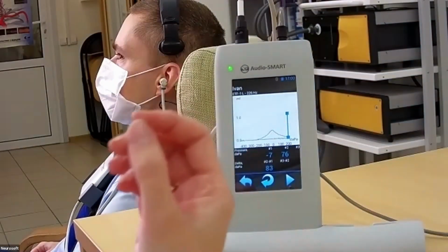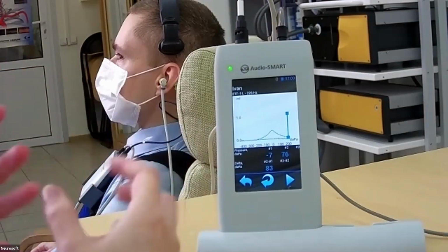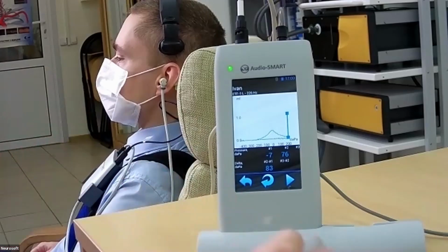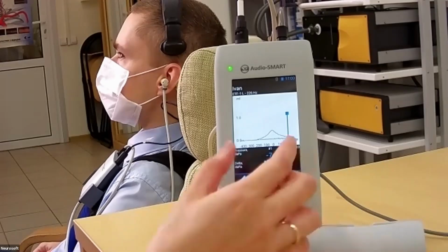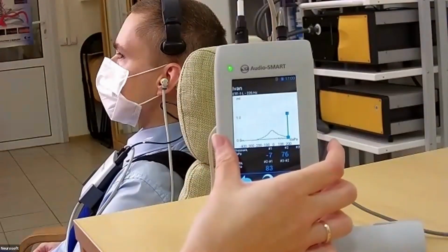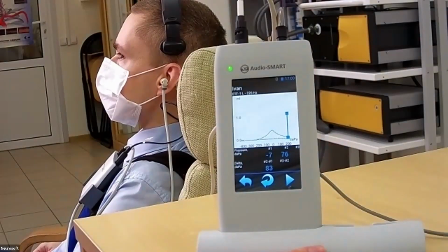We can ask the patient to swallow a little bit to make the pressure more negative, or we can make the template setup and make an extended window for our pressure values.